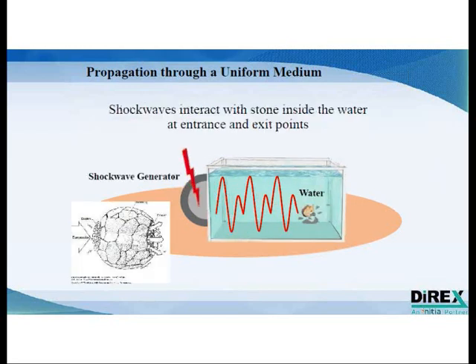Here, if you take the same scenario where you generated a shock wave inside a water medium and you place a stone inside this water medium, the shock wave will react with the stone, because the stone's density is different from that of the water, and thus there will be a reaction.